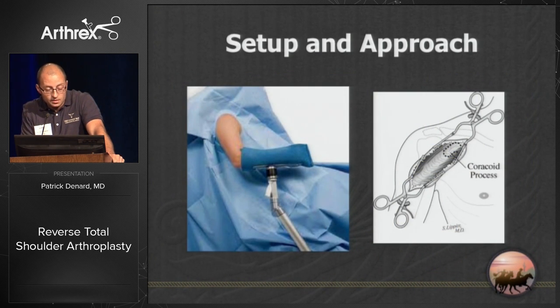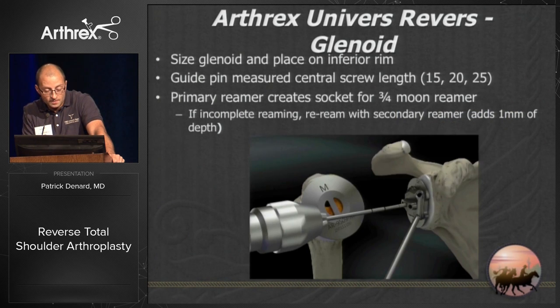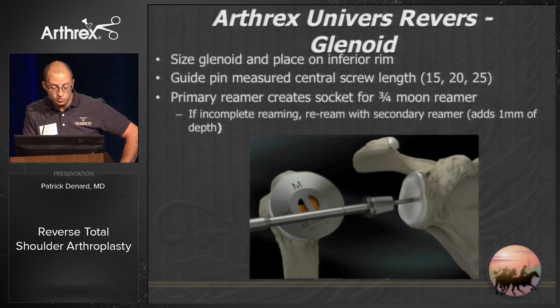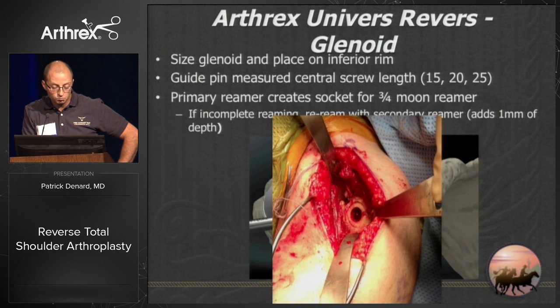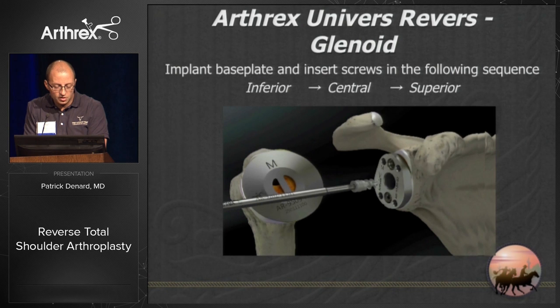Setup and approach is the same as for anatomic shoulder arthroplasty using the deltopectoral approach. You can use a freehand cut or extramedullary guide — I like the freehand cut because it's quicker. Then go to the glenoid, protect the humeral head, and use a small, medium, or large guide. A guide pin measures your central screw length — 15, 20, or 25 mm — followed by a two-step reaming process to prepare the glenoid to accept the base plate, creating an inlay for excellent initial stability.